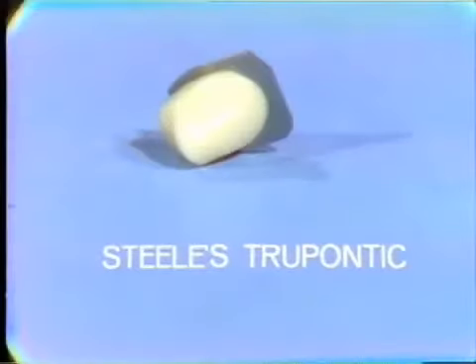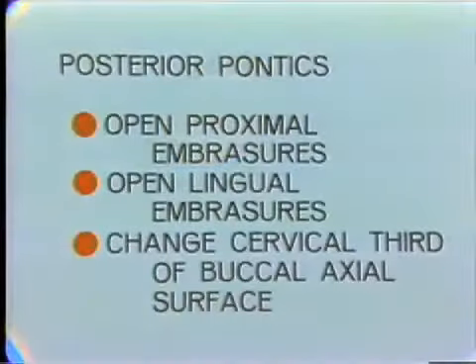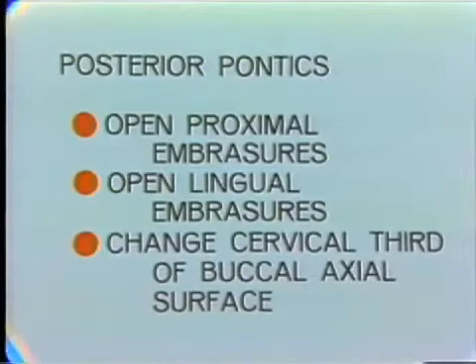Steps in the adaptation of a Steele's Trupontic for a bridge replacing the left first maxillary bicuspid tooth on a test bridge. Before we go through the technical stages of adapting the Trupontic, let's take a quick look at the key points in developing a posterior Pontic.